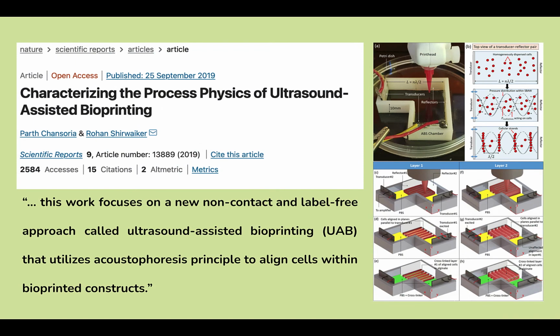In the future, ultrasound technology may aid in the development of accurate 3D bioprinting techniques. Ultrasound could potentially be used to create a detailed and personalized map for bioprinters to use as a scaffold when 3D printing organs for their patients.